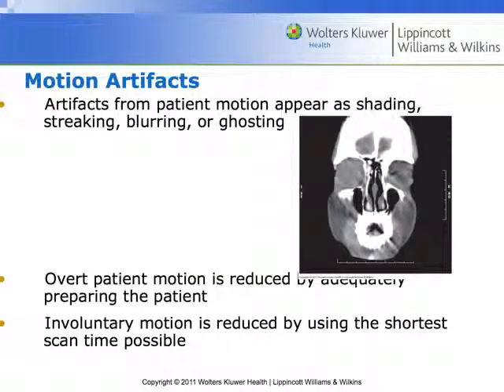Motion artifacts. Just please tell your patient to hold still, or you're going to get pictures that make them look like an evil ghost, right?